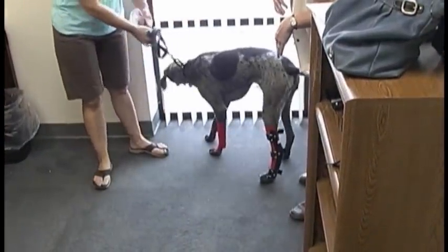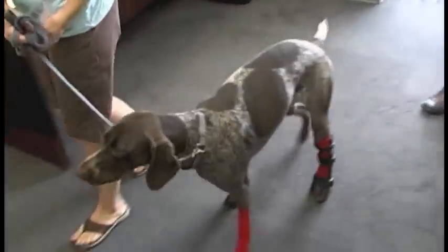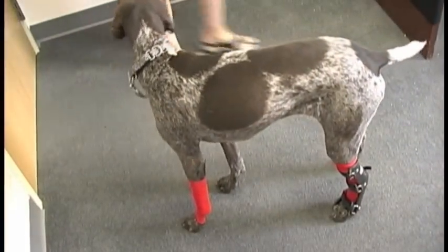Typically, how long does the dog continue to lift her leg up like that? As soon as she stops concentrating on it and gets distracted with something else, she won't lift her leg like that. That's why I'm kind of working with this — it may not work.